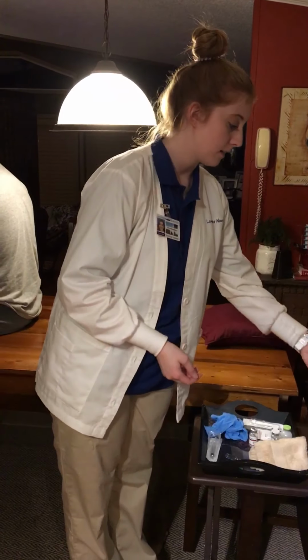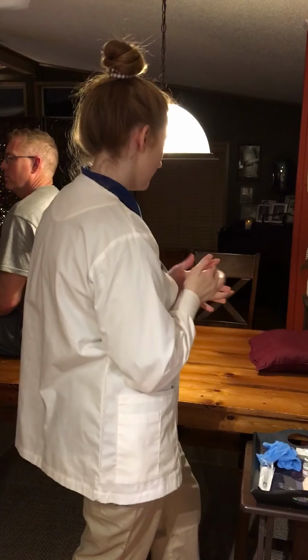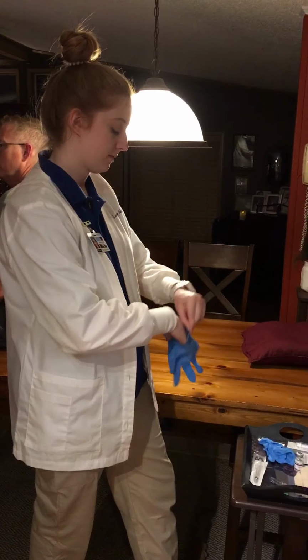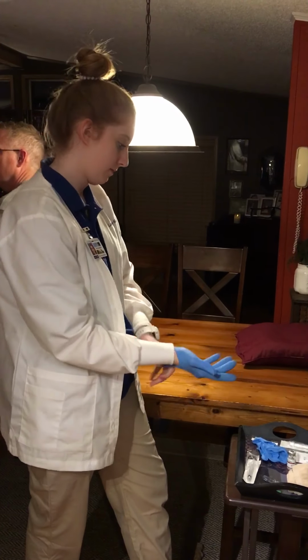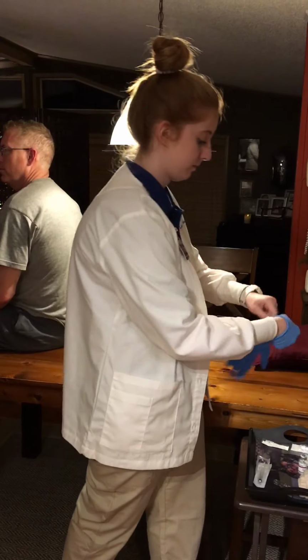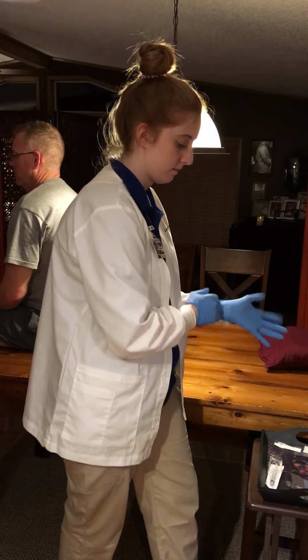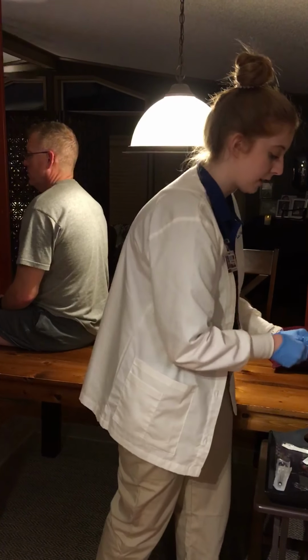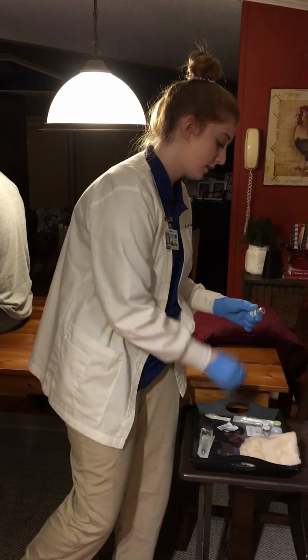And then, one second. I'm going to clean off my vial because it has been used before.